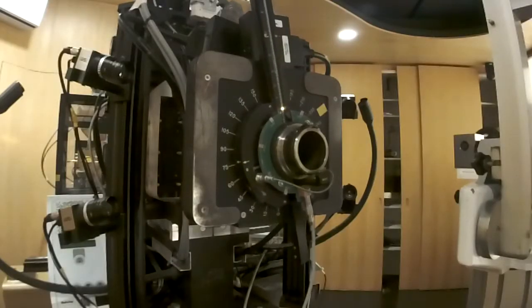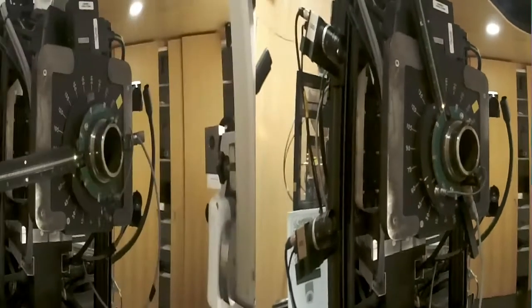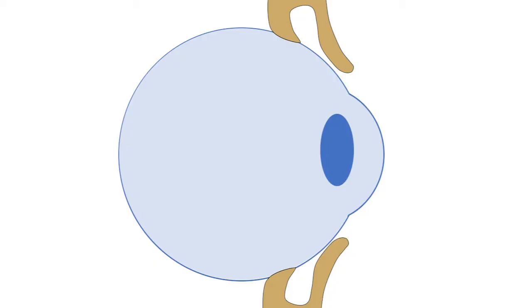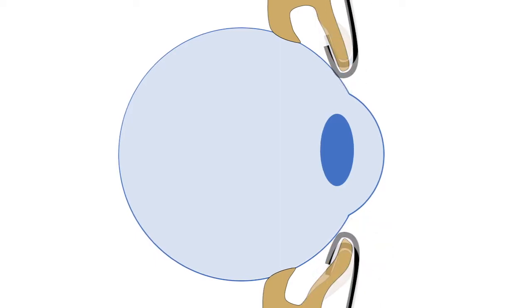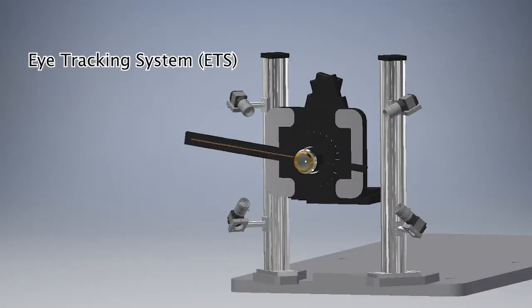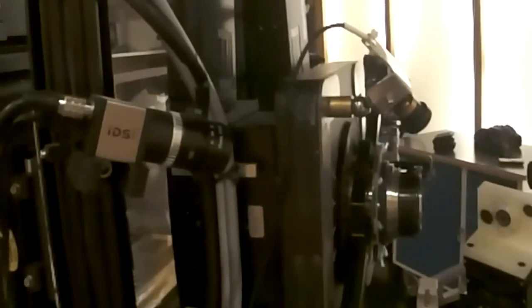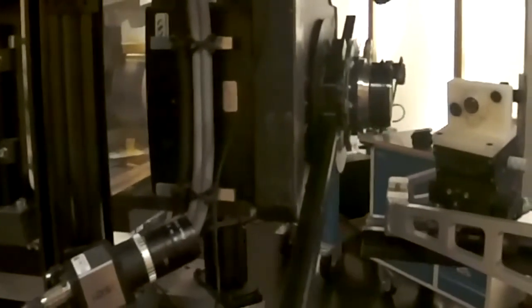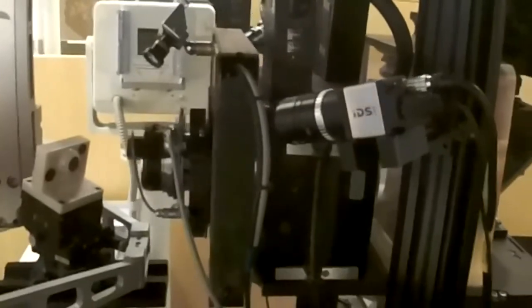Finally, during treatment delivery, the patient is asked to fixate a light, prepositioned according to the treatment plan prescriptions. In this phase, the patient wears eyelid retractors allowing for an undisturbed entrance pathway of the proton beam. An eye tracking system was integrated in the beamline. It consists of 4 optical cameras positioned, in pairs, symmetrically to the beam axis, 2 on the left side and 2 on the right side. This configuration was adopted to guarantee sufficient eye visibility by at least 2 cameras regardless of the patient gaze direction.